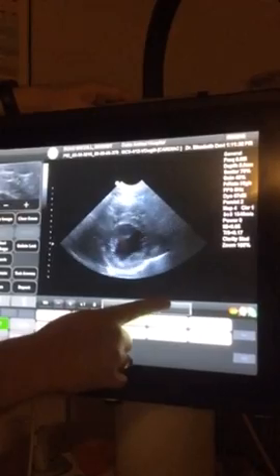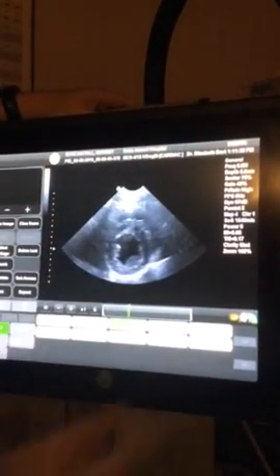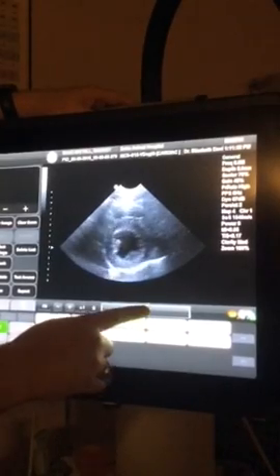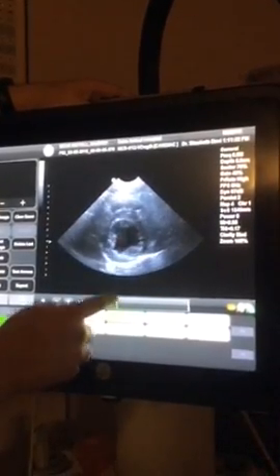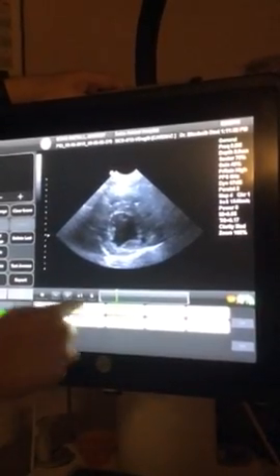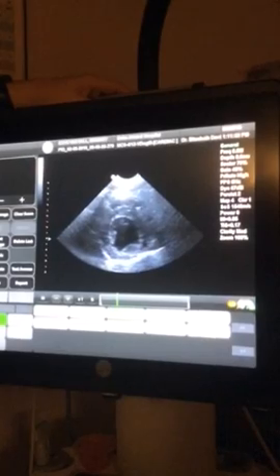Okay, so you just cycle through that image. You don't have to close the image, go find another mushroom, start back over. I tell everyone, once you find a true mushroom that's representation of the heart, the algorithm doesn't know you went and did that. It just is looking for different caliper position to help with the calculations there.